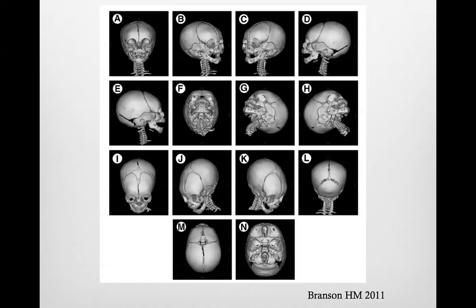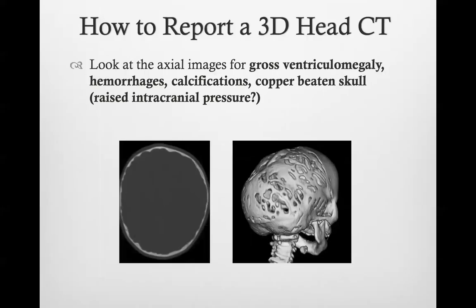Now, I would like to suggest this paper from Helen Branson and Manu Schroff from Toronto, done in 2011. They show a lot of technical parameters in approaching 3D CT. And they also give to your tech, your radiographer, this image, where they will know how many projections to create for each CT. So you always have the same projections and you can compare the scans. So it's a very useful practical paper.